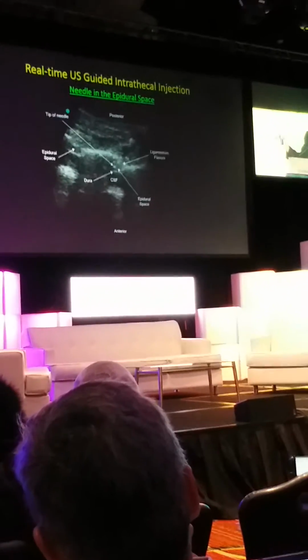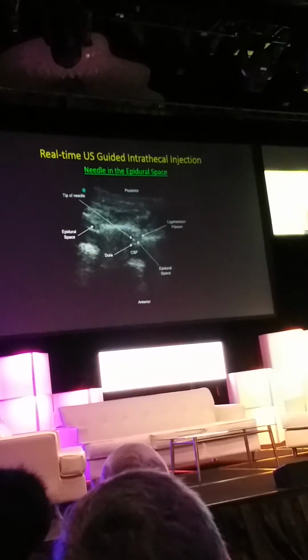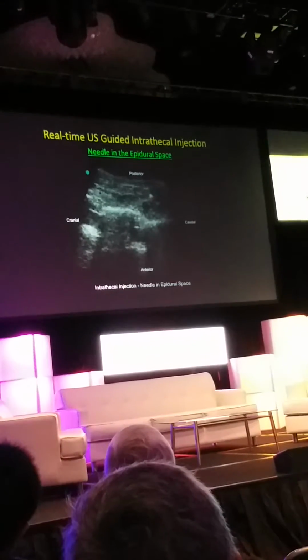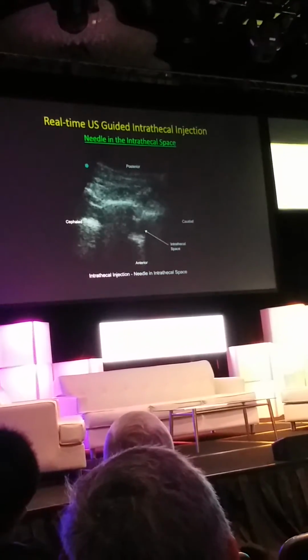By the way, all images are not always like this. This is one of the best in my archives. So often you have patients of different age groups and imaging is not as good. But nevertheless, if you can guide your needle to the interlaminar space, I think you've won the battle. And then you can advance it to the intrathecal space, which is just anterior to this.